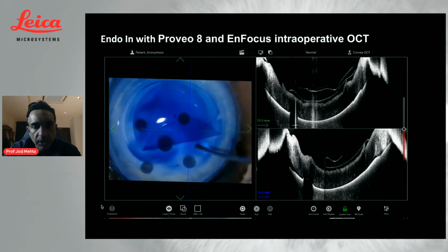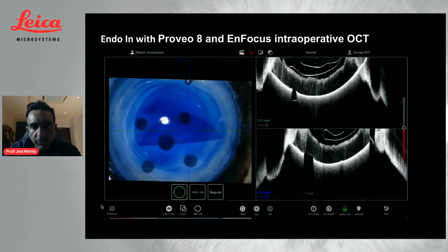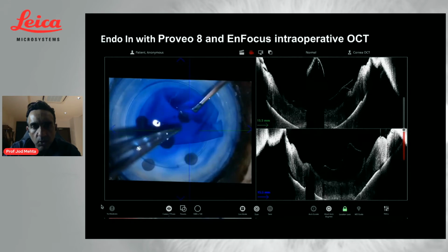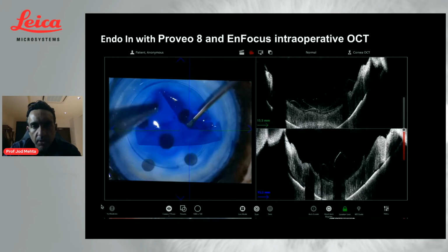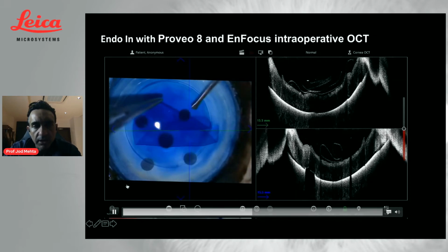Then I simply lift up one leaf of the end of the DMEK tissue, and I gently fold it over, and you can see on the OCT that I've got fluid between the two leaves of the graft of the Descemet's membrane, so they will not touch each other when I put the endothelium on the surface. This is what a lot of people find a little bit tricky, how much fluid to put in. If you put too much fluid, then you can't fold it up like this, because the tendency for the graft is always to be with the endothelium on the outside.